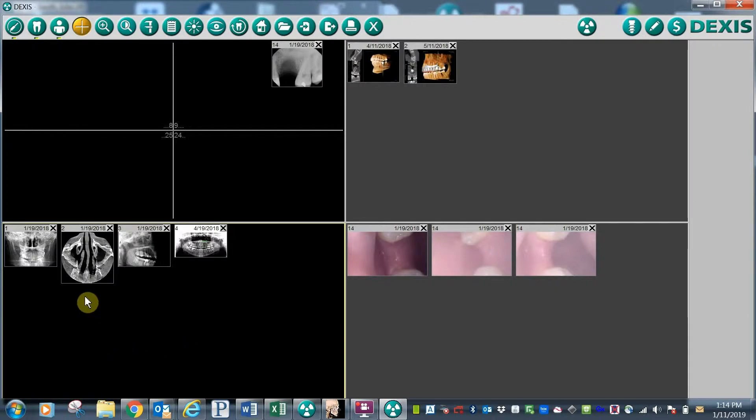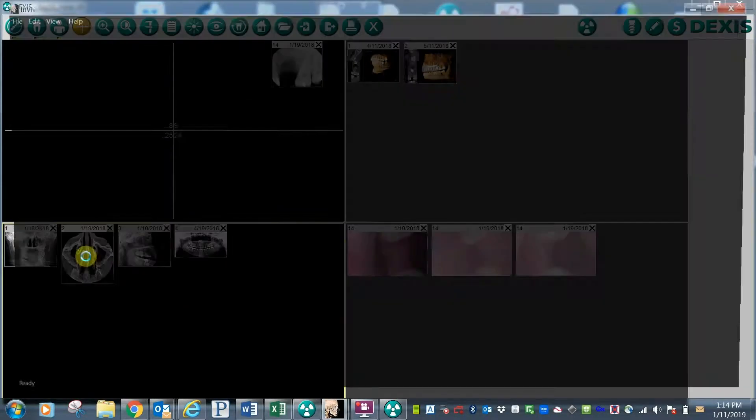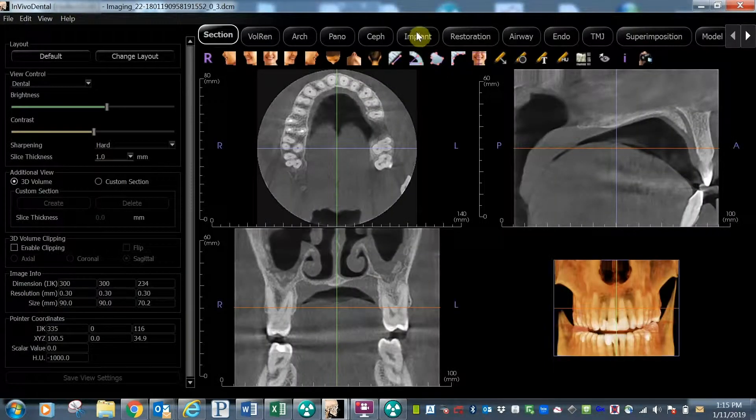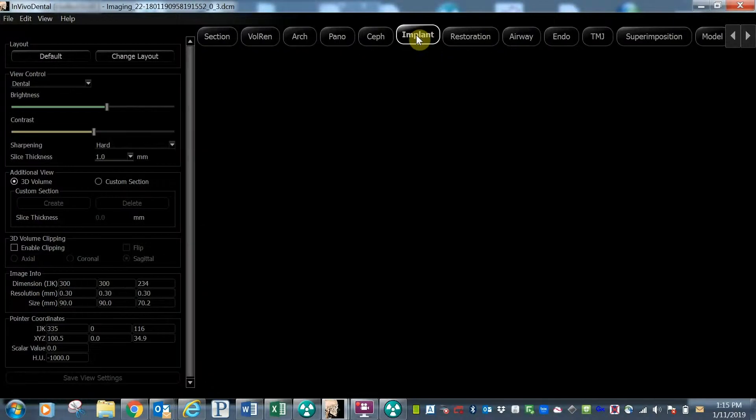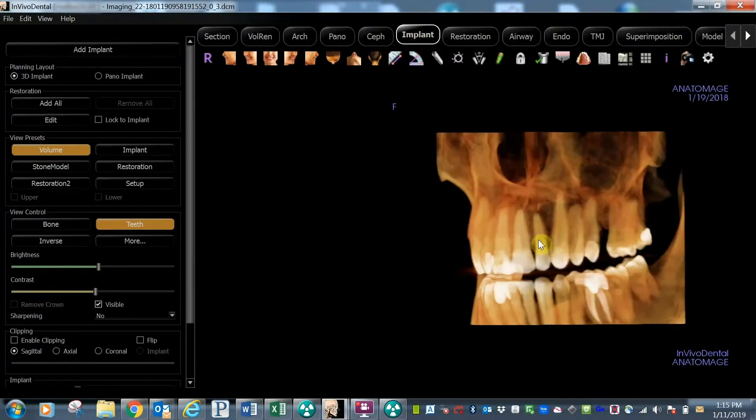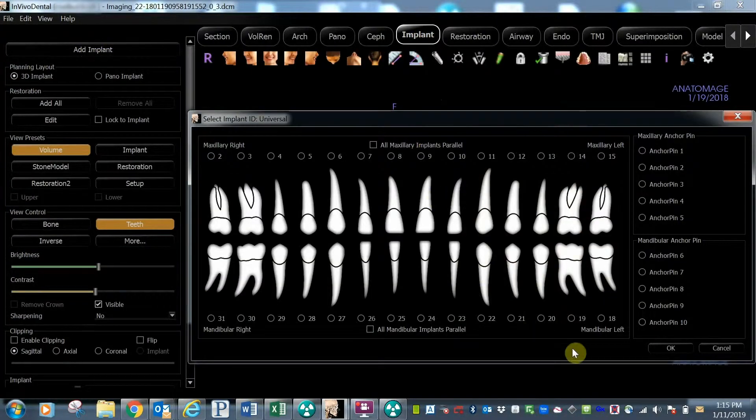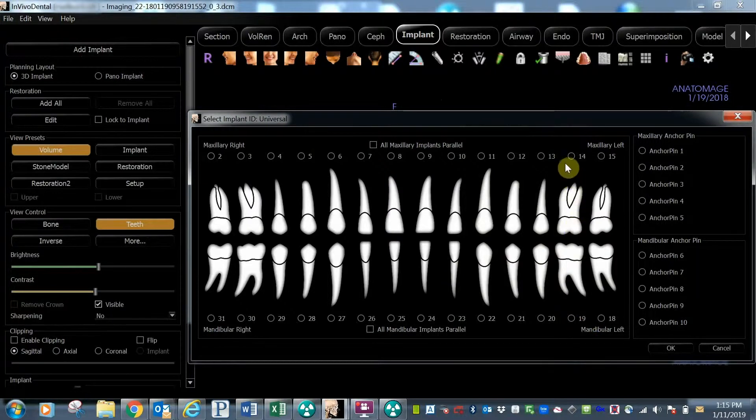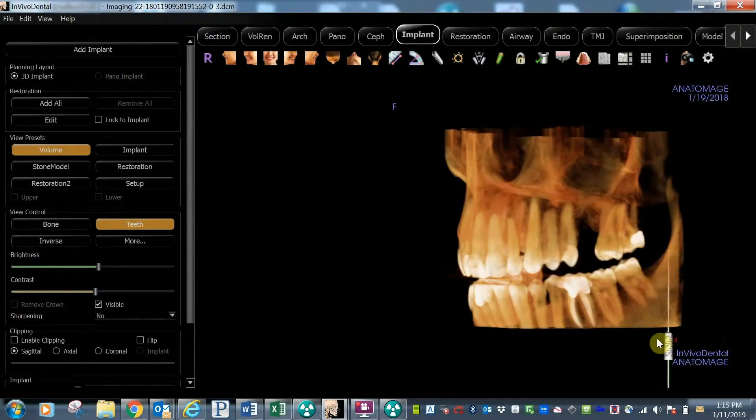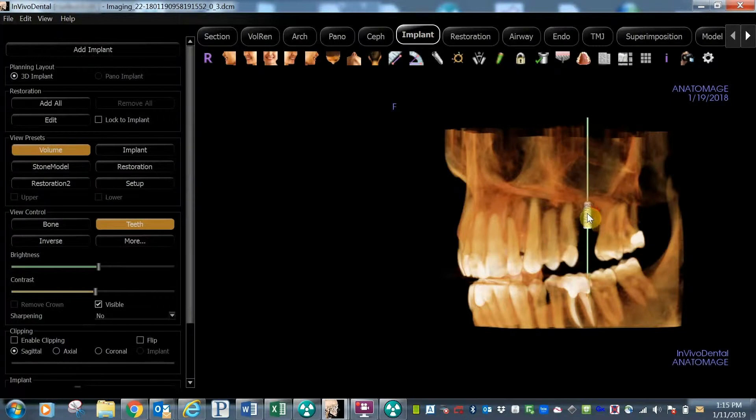To launch the InVivo 3D software, simply click on a 3D scan in the bottom left quadrant. Next, click the implant tab and select the add implant button. Select the tooth number and then drag and drop your implant into place.